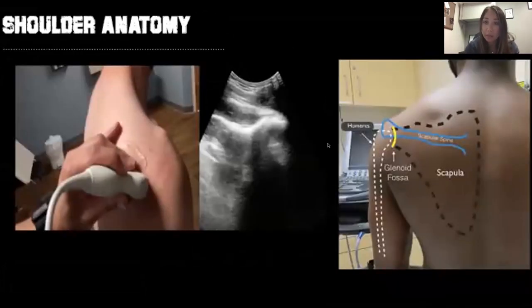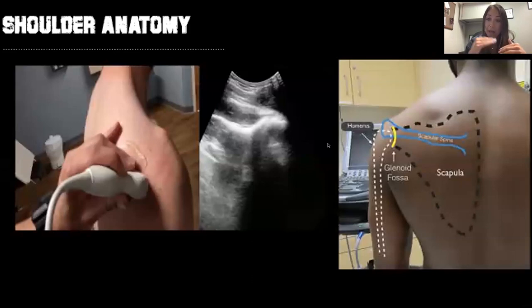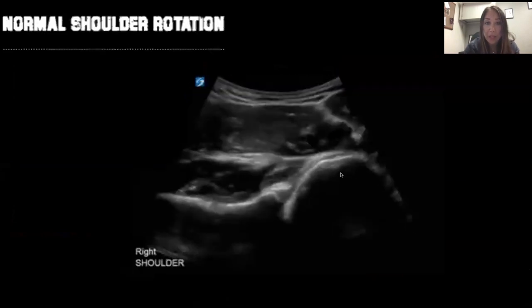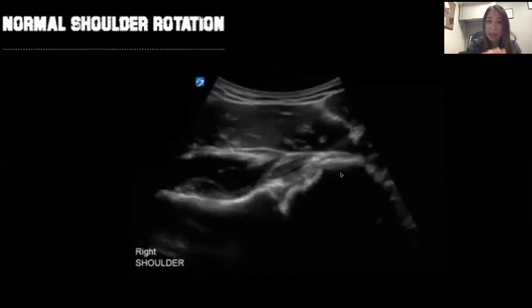Shoulder complaints are very common in the emergency department and ultrasound is a great utility for diagnosis. When doing a shoulder ultrasound we come from the posterior aspect — anything posterior on our screen is anatomically anterior. You want to initially find your scapular spine, then your glenoid fossa, then the humeral head. Here's normal shoulder anatomy: scapular spine, glenoid fossa, and humeral head. Normally when you have the patient internally and externally rotate, you can see everything is together and in alignment.